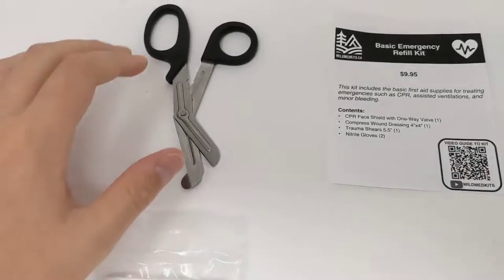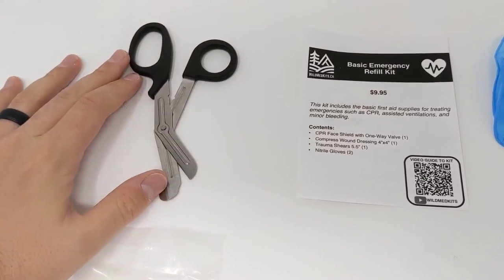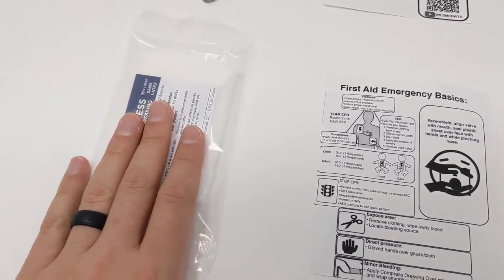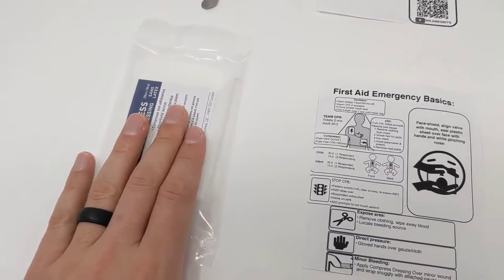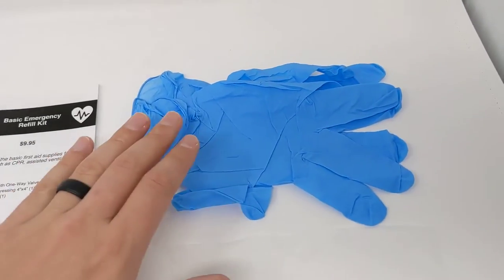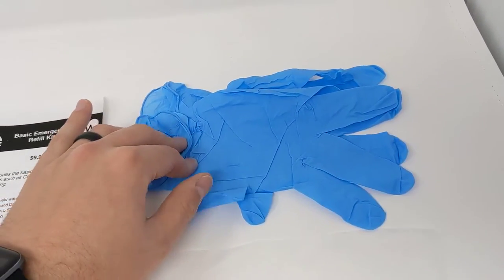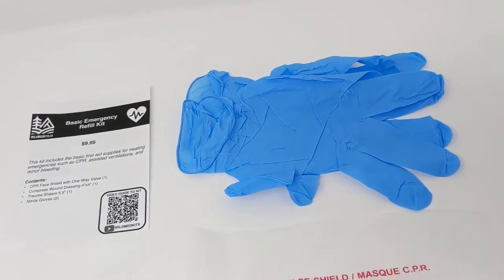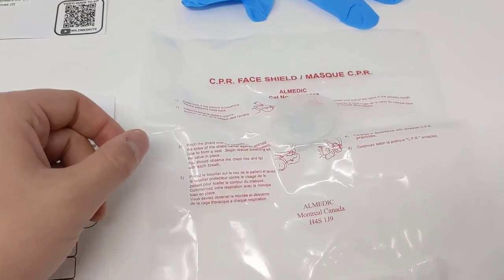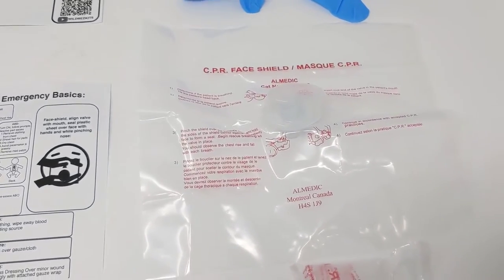This kit comes with a high quality pair of trauma shears to cut through clothing to expose injuries. It comes with a four inch compress dressing to treat minor to moderate wounds and bleeding. It comes with a pair of high quality durable nitrile gloves for personal protection, as well as a CPR face shield that's again really high quality and durable for personal protection while doing CPR.